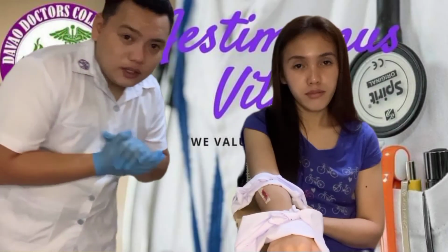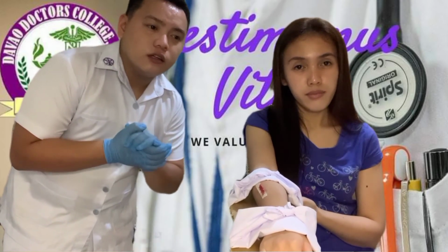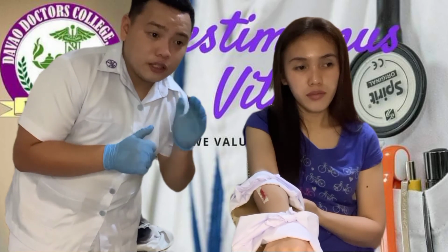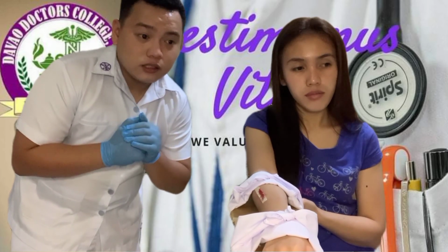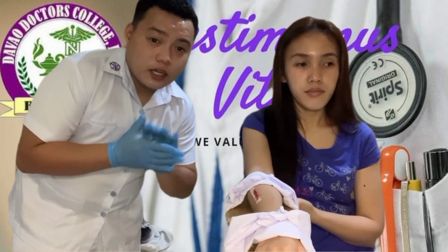And so the last step is we proceed to the nearest medical facility or hospital. After checking for the circulation, the patient is now ready to be transported to the nearest hospital. This is important so that the patient can have a checkup like diagnostic tests and follow-up checkups, and also to be given proper medical attention.